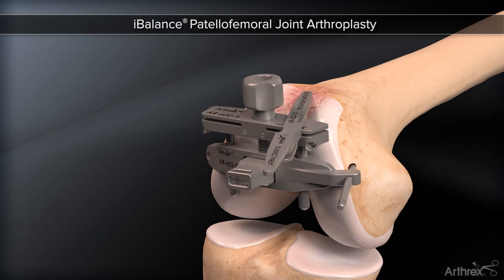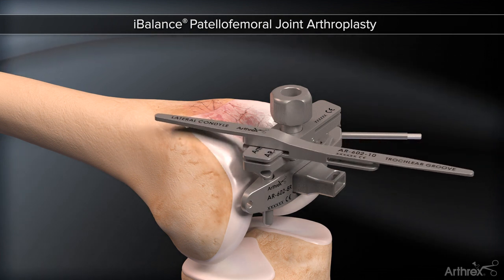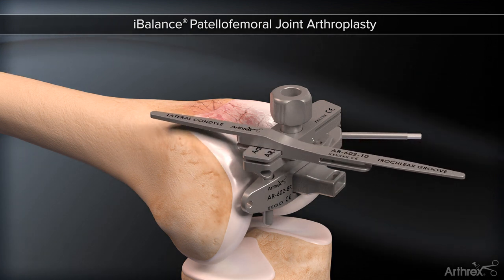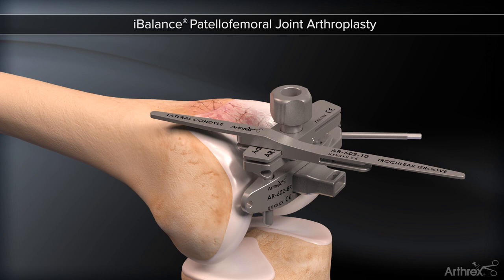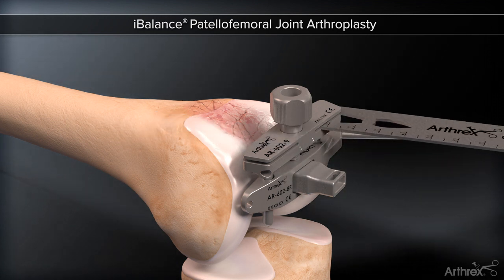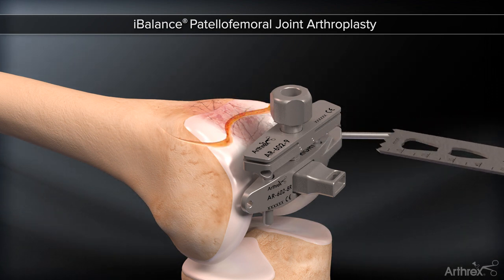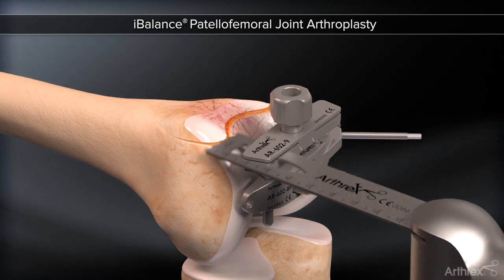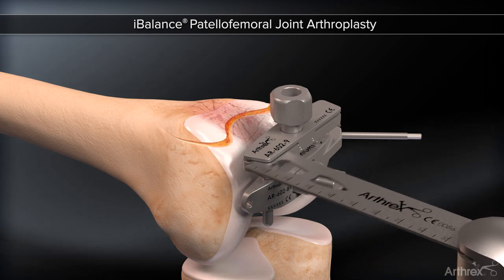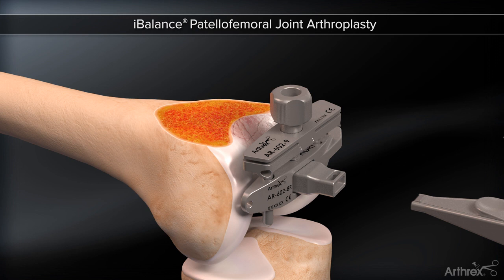The level of resection is established by a single stylus, representing the thickness of all size components, which minimizes the risk of overstuffing — first at the depth of the trochlea, followed by the anterior aspect of the lateral condyle. This captured guide may be pinned into place and the resection is performed. The cutting guide and all alignment instrumentation is removed.